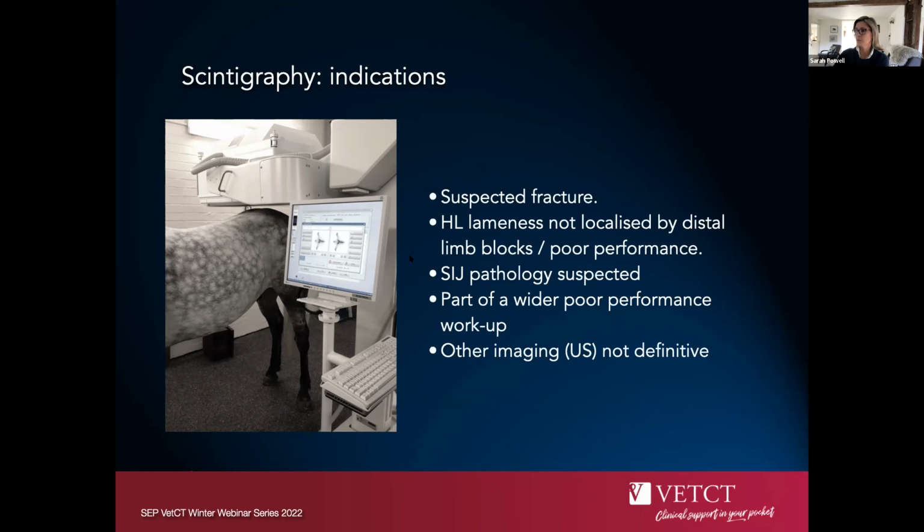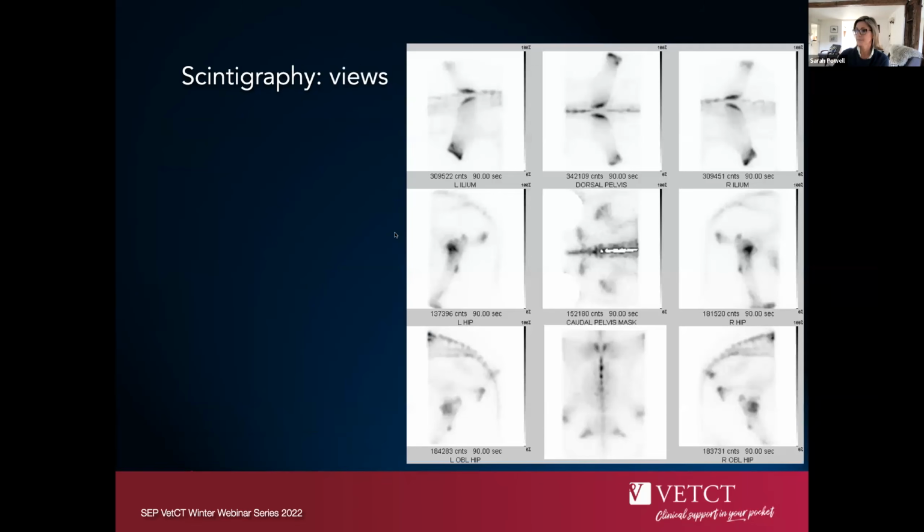And as part of a wider poor performance workup, so obviously the types of cases that Lucy was presenting earlier, in those cases you would of course also routinely scan through the back and pelvis to make sure that there's nothing additionally that we need to know about.